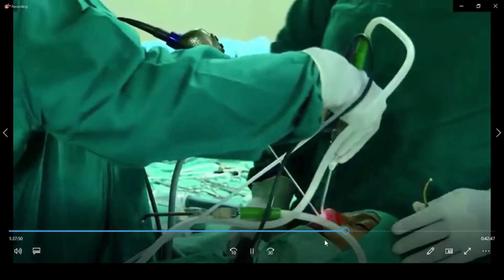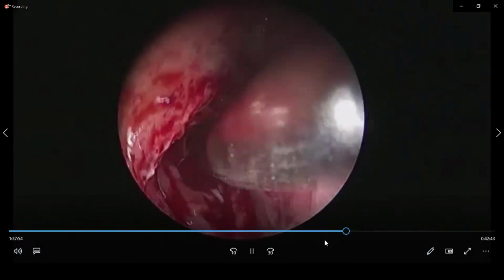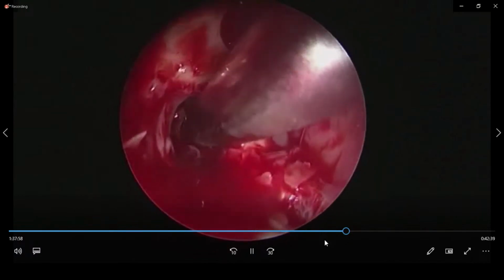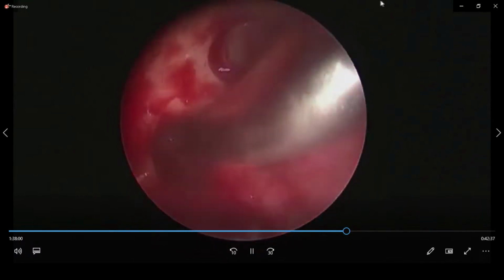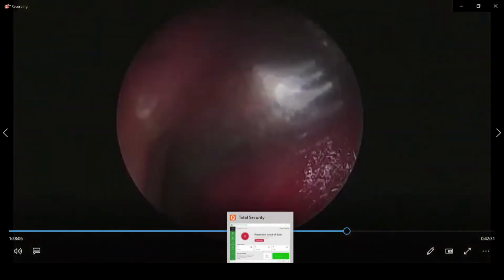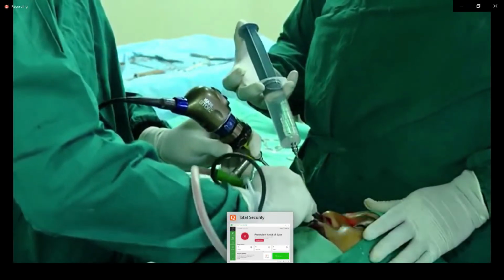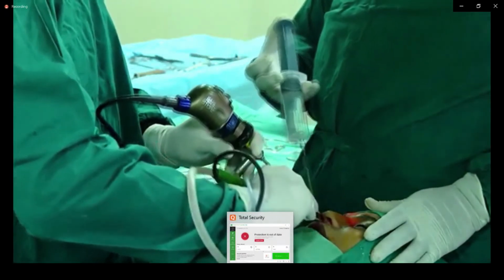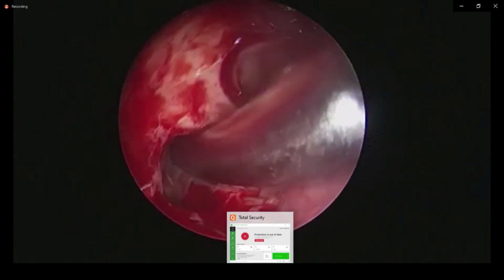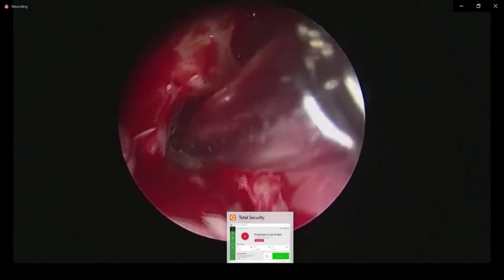You should get used to differentiating between cells and the party walls from the look. All these are important. If the beak is a larger one, then you can drill this area, the beak area. Yes. If the big beak is an obstruction, narrowing, with the cell going up, we should not think twice before drilling this beak. So that beak should be drilled.